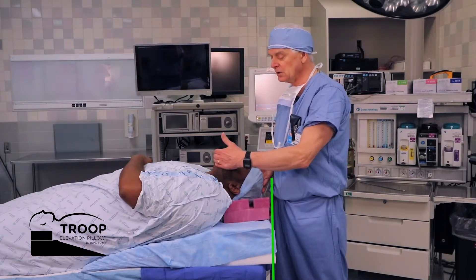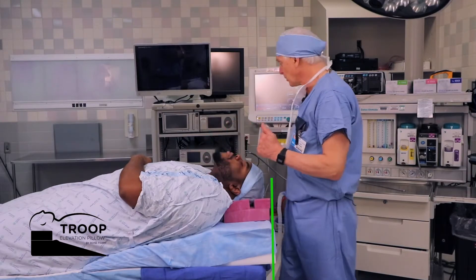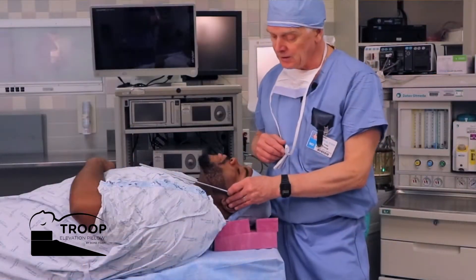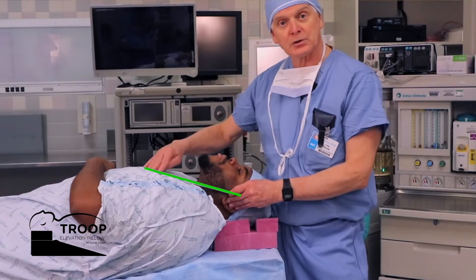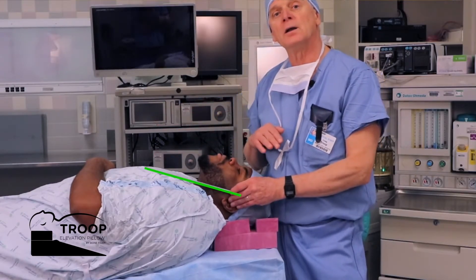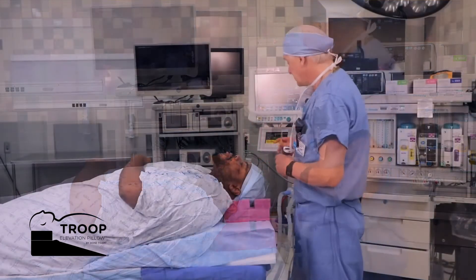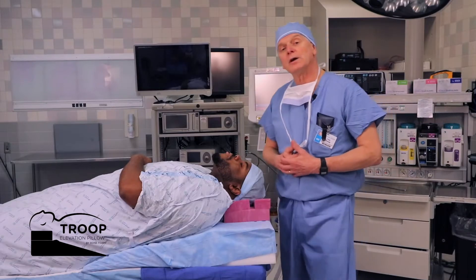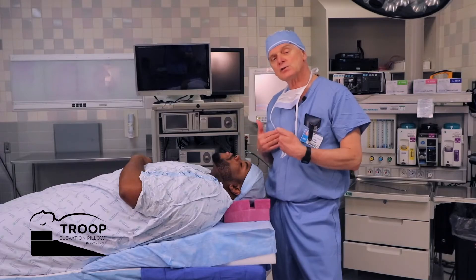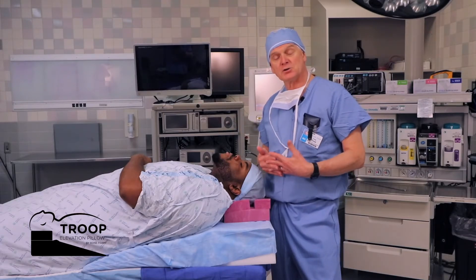With a little bit of extension of Quinton's cervical spine, we're going to see that the three airway axes, as demonstrated by the imaginary line from the ear to the suprasternal notch, that imaginary line is now much more parallel to the OR table and to the floor. That is a summation of the three airway axes aligning, and this will facilitate a successful first pass intubation.